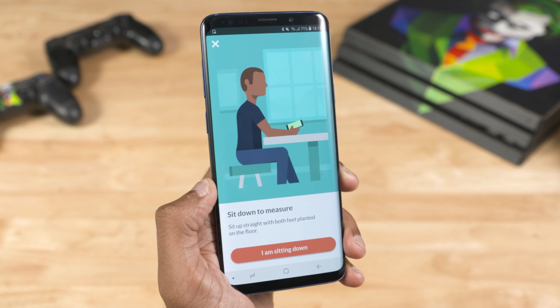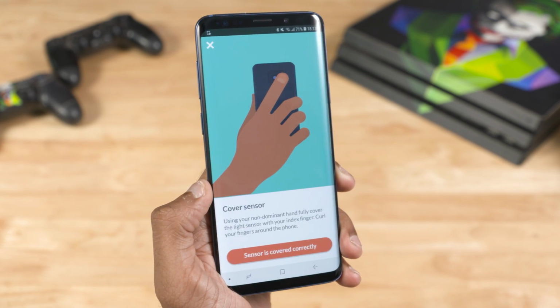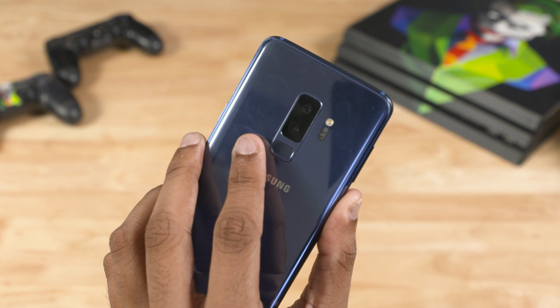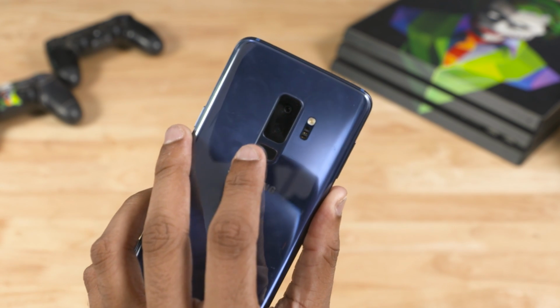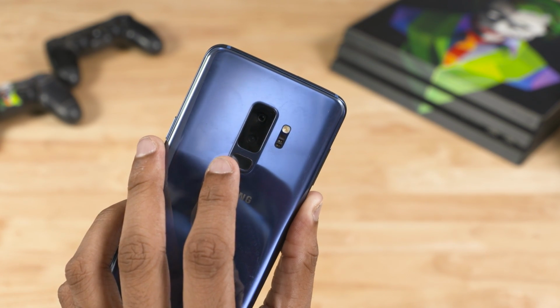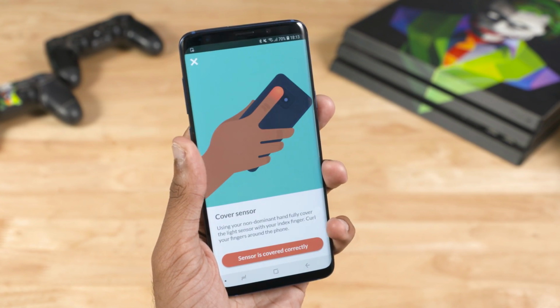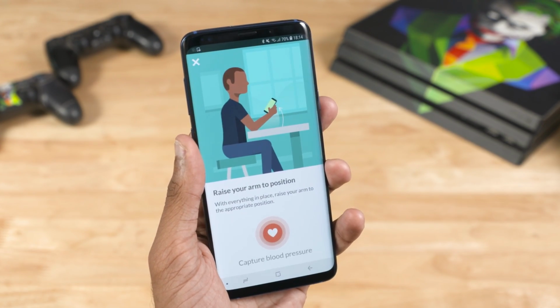Now the app will tell you how to use the S9's inbuilt blood pressure sensor. Sit down on a chair and maintain a straight posture. Then with your non-dominant hand, grip the phone and cover the light sensor with your index finger. Now, we had to do this a few times. Remember not to press down too hard on the sensor itself and ensure your finger is clean.